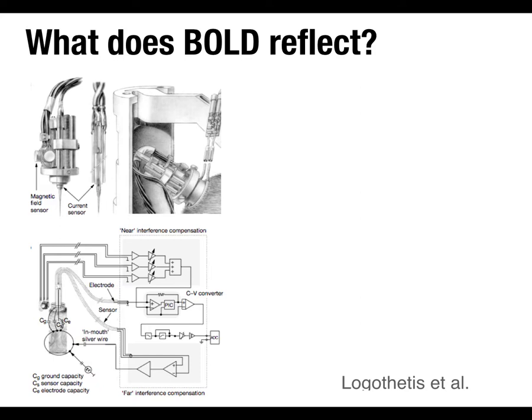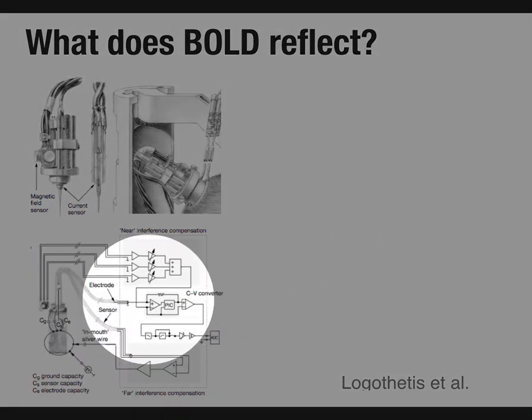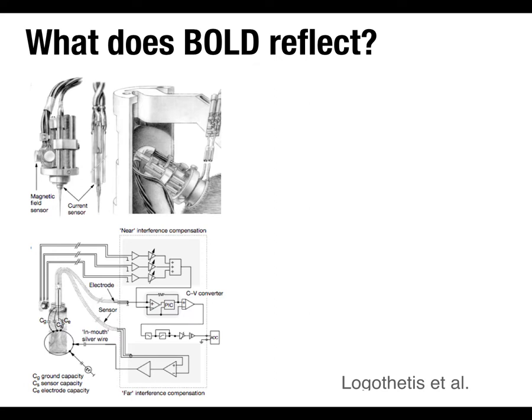Without going into all the details, I show this mostly just to show you that it's super complicated. This is the electrode itself, and it had all this stuff on it, kind of like MEG, where you've got the active shielding, so you're measuring all the electromagnetic waves that are hitting the MEG scanner in the room and trying to subtract those out. They did this on a small scale by having sensors on the electrodes that were measuring the impinging magnetic fields. And then there was a lot too.